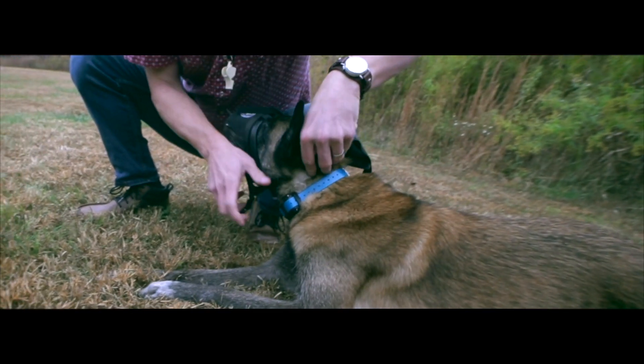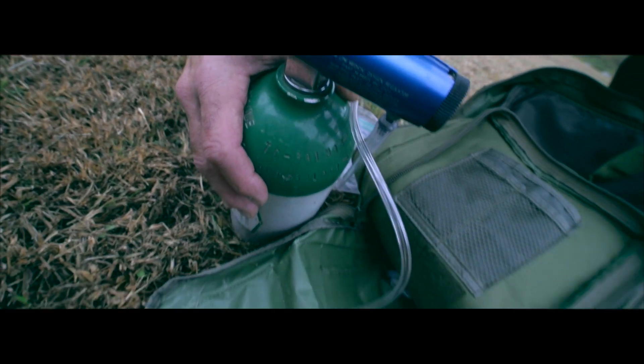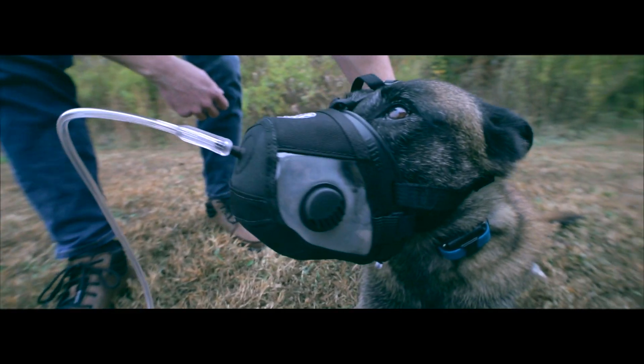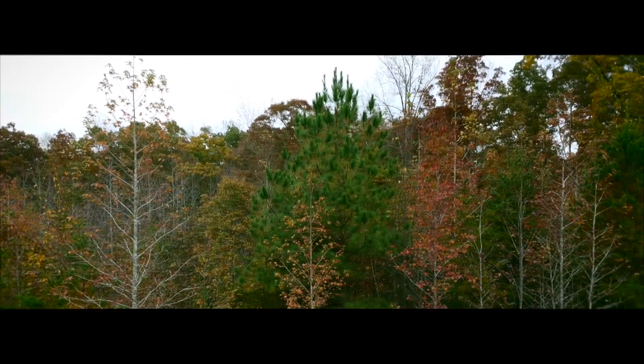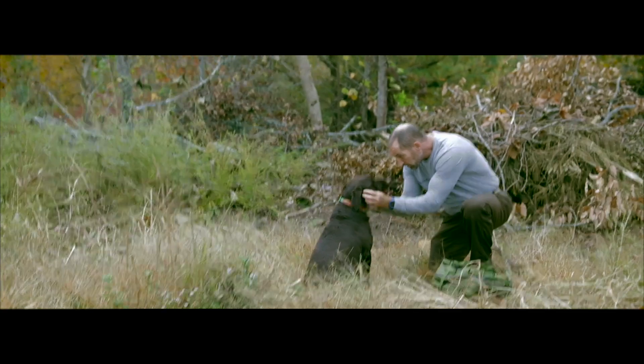Be it trauma, heat injury, or an unknown cause, our QuickClip oxygen muzzle allows for expedient oxygen therapy in the field. The muzzle is compatible and adjustable to fit a variety of dog breeds and snout sizes, and if necessary, will even fit over an existing muzzle, combining safety and oxygen therapy into one design.